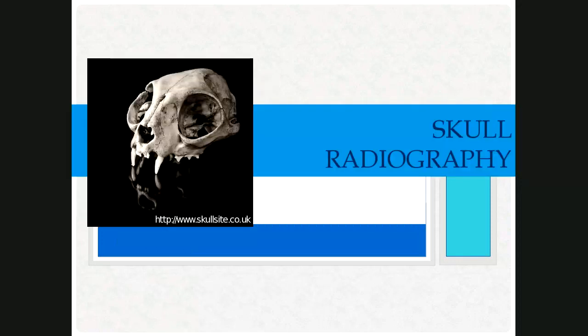So the skull encompasses the brain and houses the sense organs for hearing, equilibrium, sight, smell, and taste, and it provides attachment for teeth, the tongue, the larynx, and muscles. And it's a very complex structure with more than 50 bones, teeth, cartilage, soft tissues, and so superimposition of features is hard to avoid, and this is what makes radiographs very tricky.